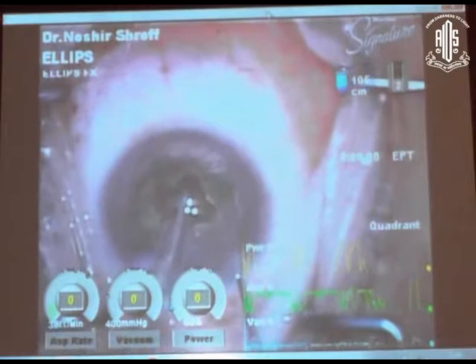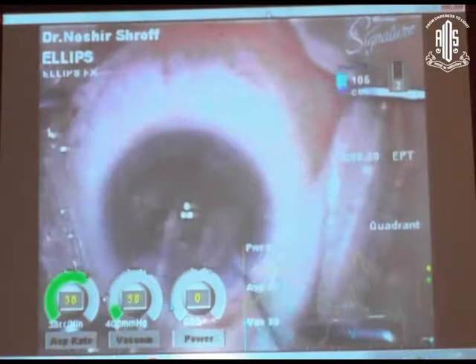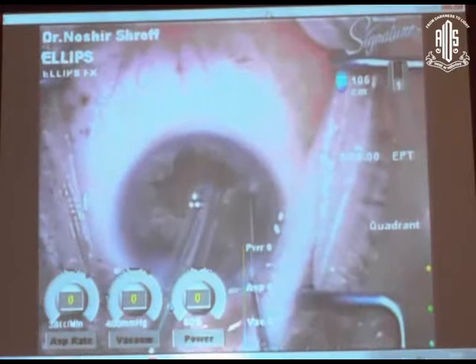Now the second stage I want to show is it's a good hold. At 400 mmHg, you get such a good hold. Even if you go up to 600 mmHg vacuum, the hold is very good, but when the occlusion breaks, there is no surge. That is because of the occlusion mode phaco and the CASE vacuum. You see this is being cracked now. And look at the hold that there is there.